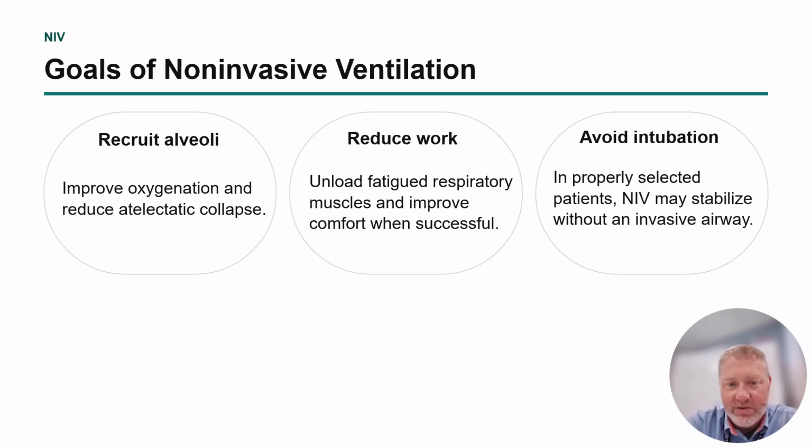BiPAP is bi-level, or two levels, of positive airway pressure. The goals are to recruit alveoli to improve oxygenation, to reduce or prevent airway collapse or atelectasis, to reduce work of breathing, and in most cases to avoid intubation.